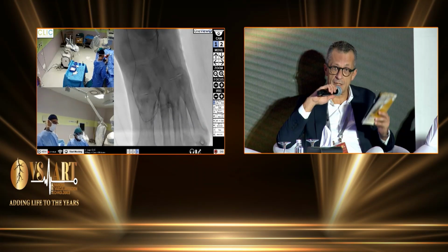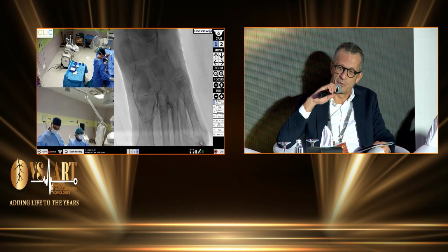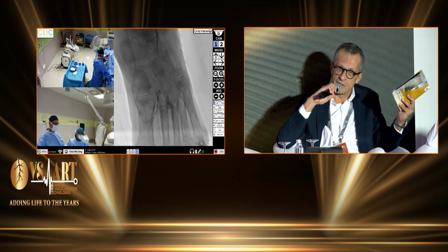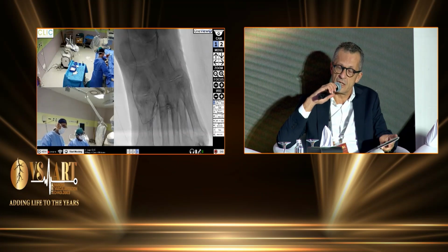From my side, now I change completely my approach, and now I use the sirolimus. I hope this is a good idea. I'm not sure. It's not possible to compare now the result of sirolimus with paclitaxel, of course. Thousands of patients treated with paclitaxel, 100 of patients with sirolimus. But the slow flow phenomena, in my opinion, is a really important reason of failure.